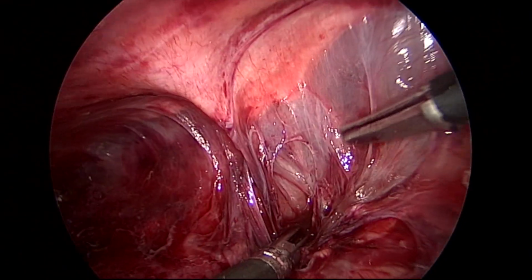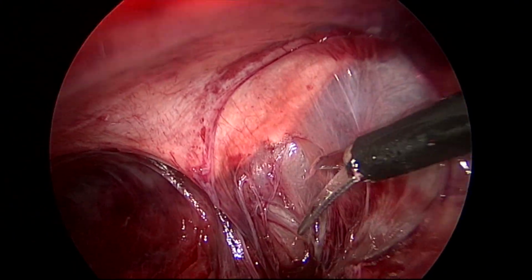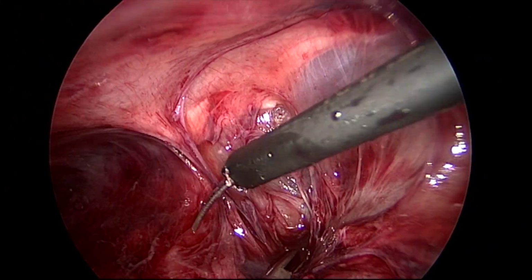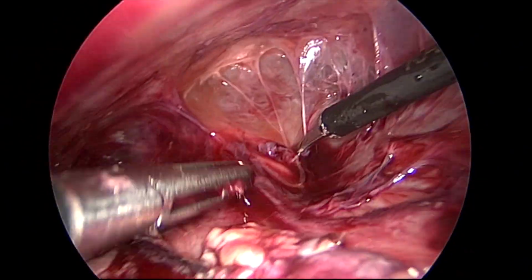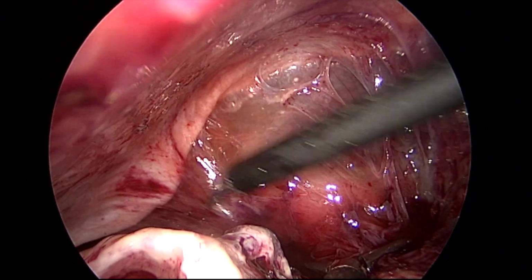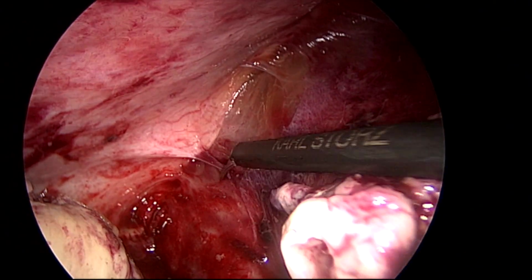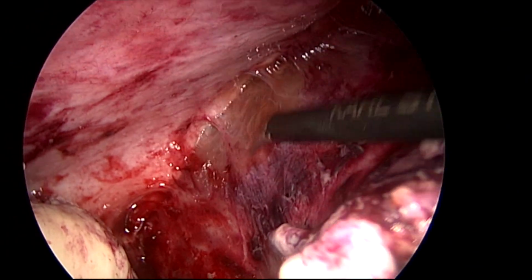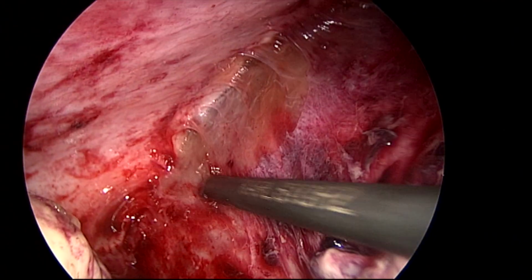So you can see dense adhesions. The inflammatory phlegmon has become like a fibrous structure because of that long waiting time. I am separating the adhesions between the liver and the diaphragm, the right lobe of the liver and the diaphragm. You can see the fluid is coming. These are all toxic fluid. You can take out all the adhesions. You have to give a nice wash with saline, so that the patient's recovery will be faster.